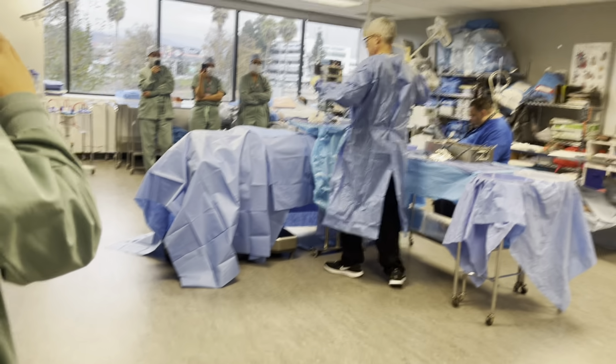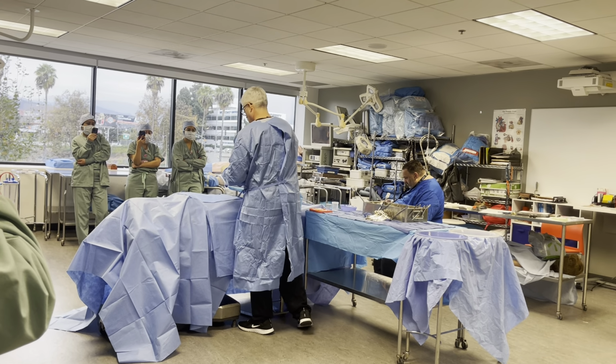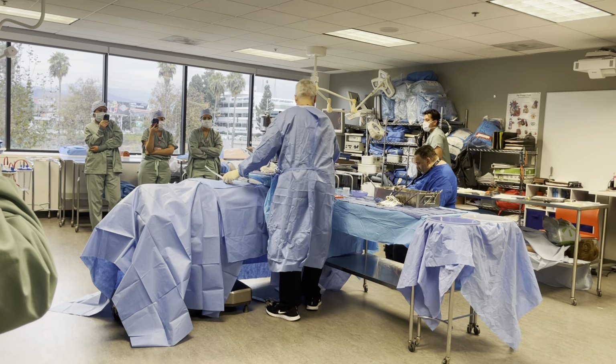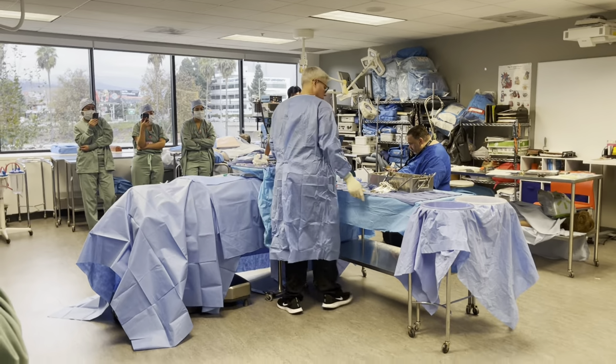What is the instrument you're using? That's a non-penetrating clamp. Last thing I want to do is put holes in my drape, because bacteria and stuff comes from here.